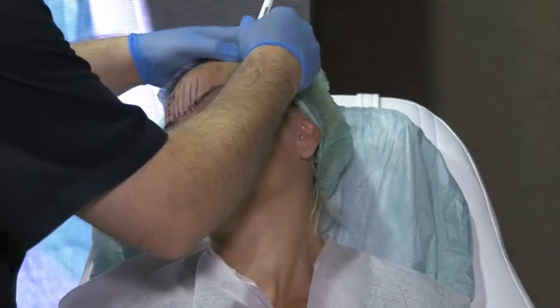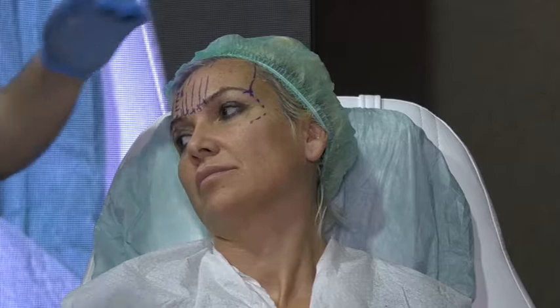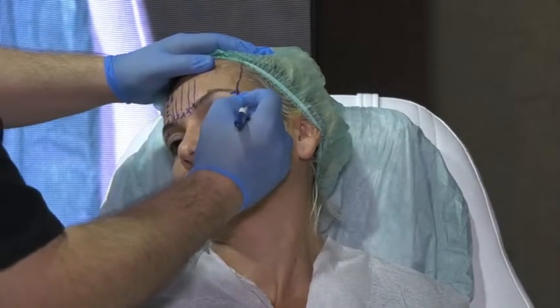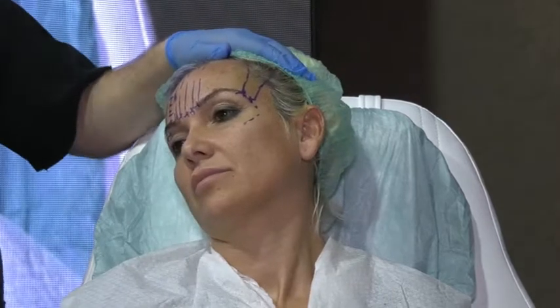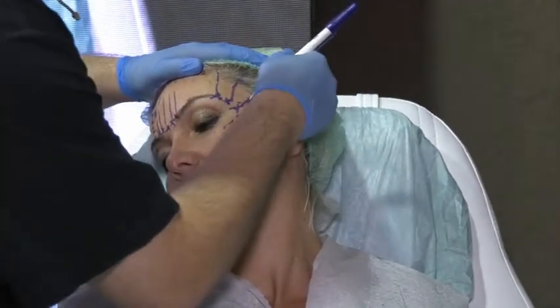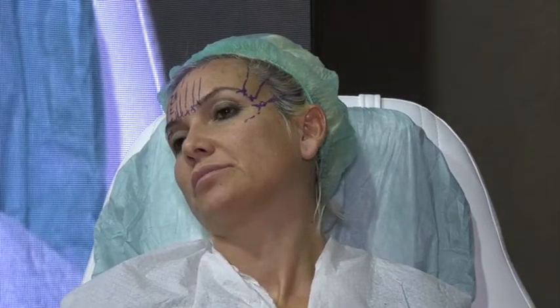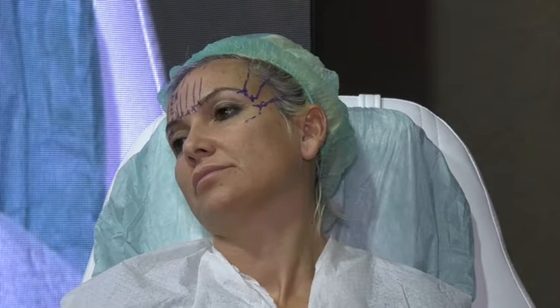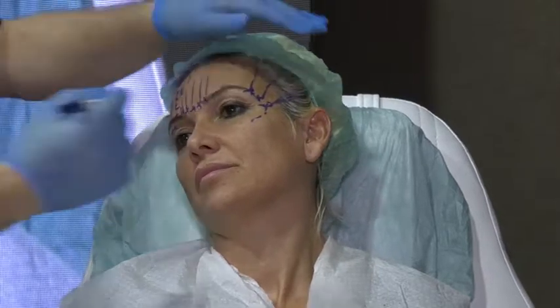This is 1. Okay? This is 2. This is 3. In some cases, you may need even 4, more down, in between. But it is like this. Okay? Like that.